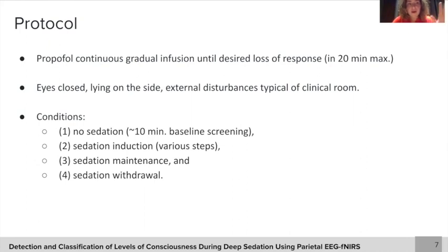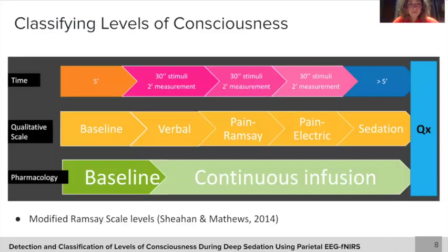And so we have four main conditions. One would be no sedation, where we would do a baseline screening. Another one, sedation induction, which has various steps of interest, then sedation maintenance, and then sedation withdrawal. In the induction of anesthesia, we will use a qualitative scale of measurement of levels of consciousness, which is what is mostly used in endoscopy procedures.